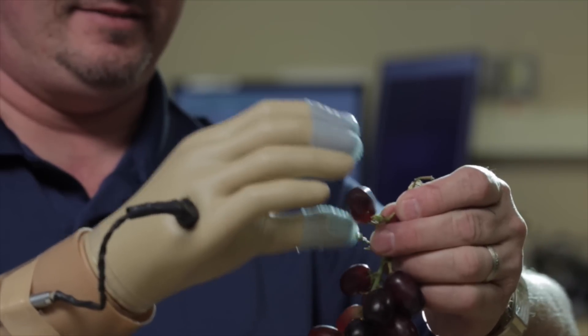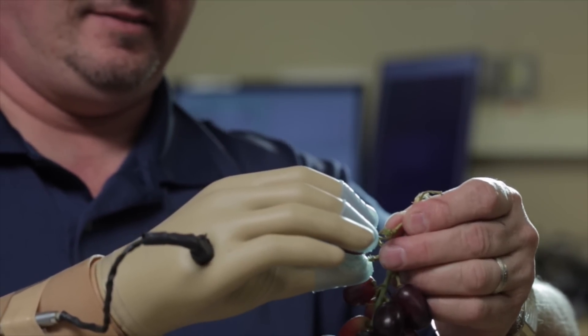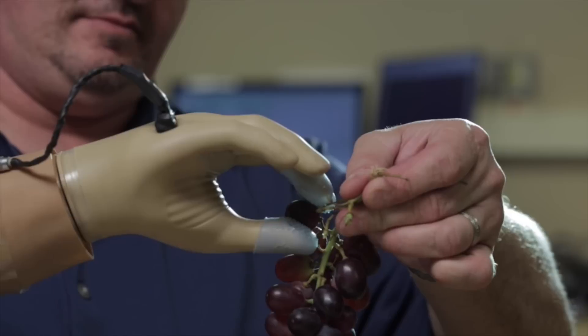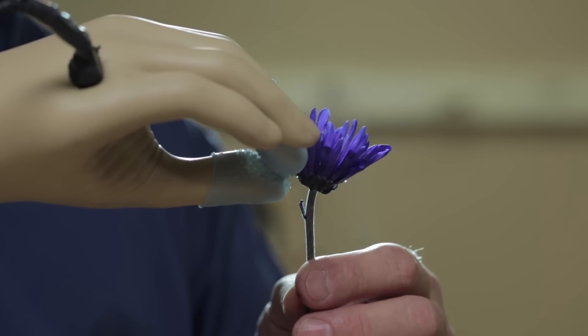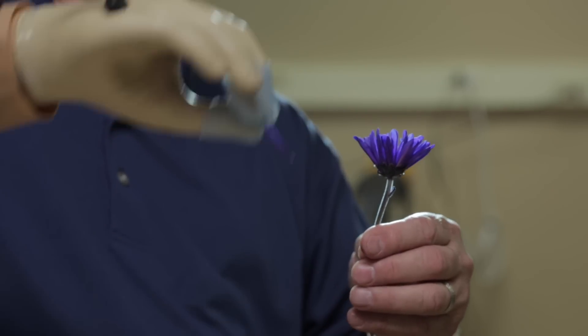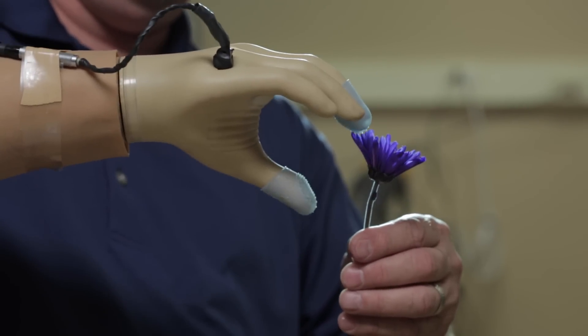When somebody loses their hand or an appendage, we often think about just the function that's been lost. The reality is they've also lost all the sensory connection. And that is probably the thing that makes us human in many ways — it's the piece that connects us to the world around us and the piece that connects us to other people.